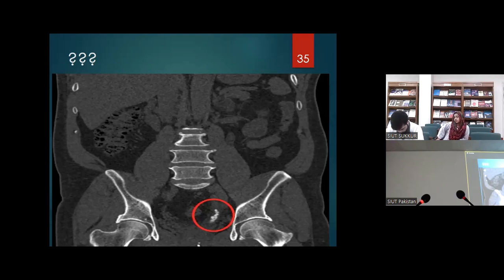Any decompression, analgesia, bladder to empty.